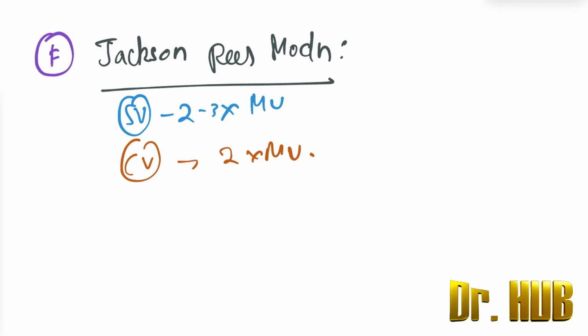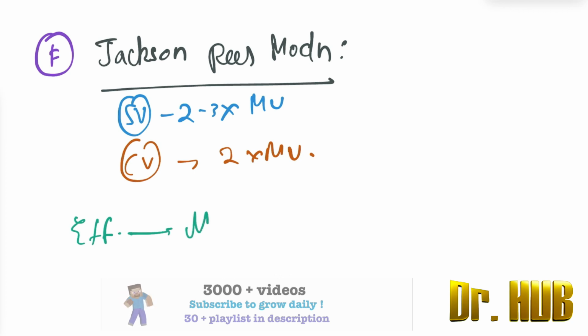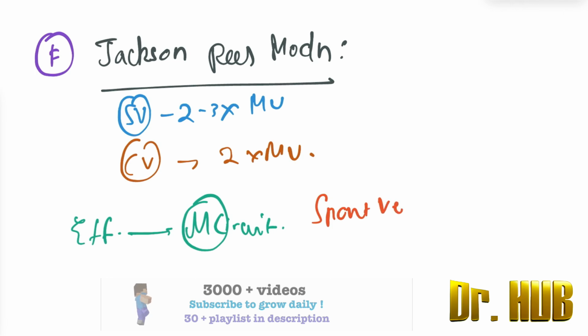So let's take a note of what all are present. The efficiency of the Mapleson circuit in spontaneous ventilation: we are going to see the order. The order is A greater than DFE, and this is greater than CB. Okay, so A greater than DFE, greater than CB.